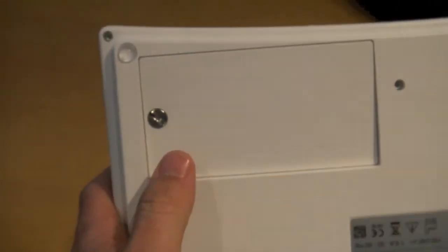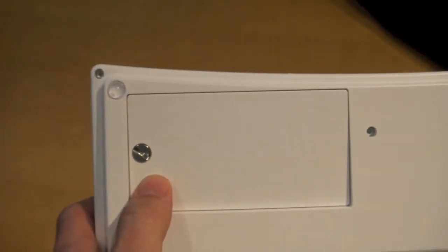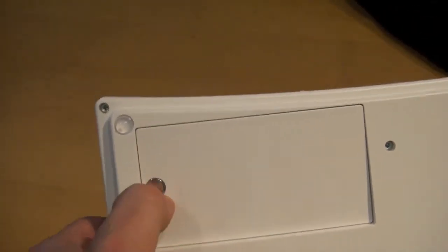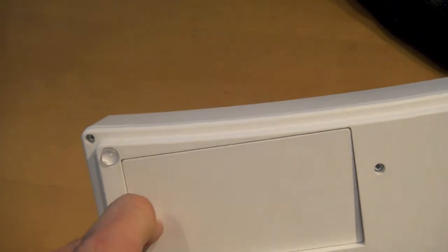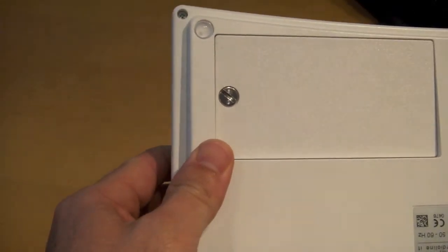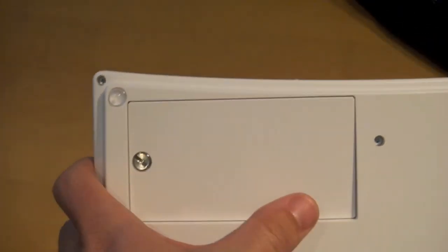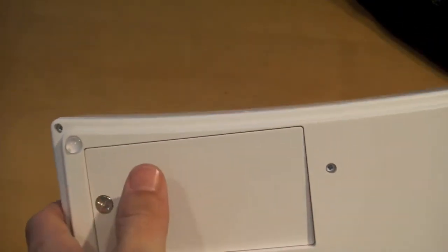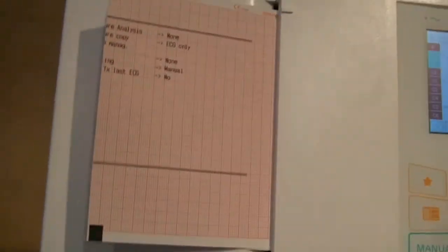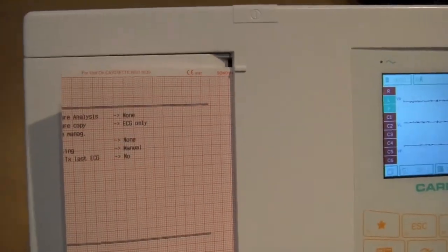The bottom of the machine features the battery door, which is taken out with a coin, very easy to get to if you need to. And there is also a micro USB slot on the inside of the machine if you ever need to upgrade firmware.